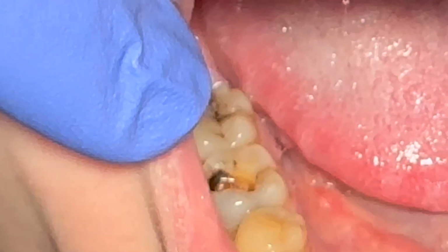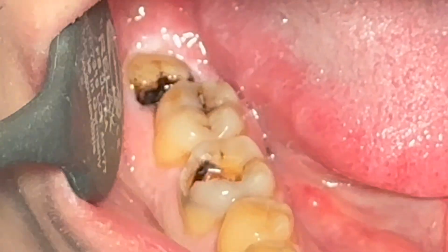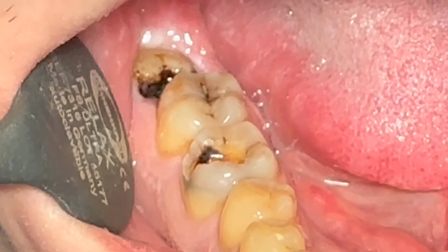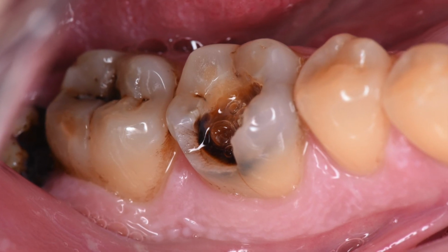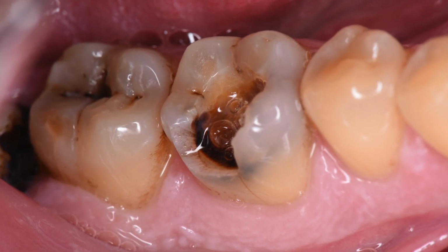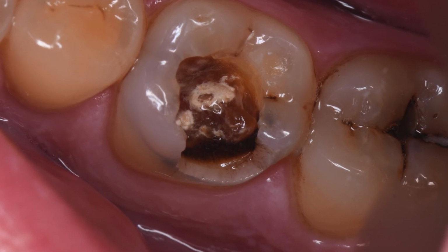In this clinical case, the patient has a large carious cavity after a large old restoration fell out, and my task was to restore the posterior tooth of the lower jaw with the creation of the correct morphology and intertubercular contacts with the antagonist in the upper jaw.